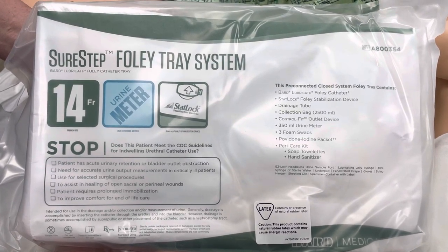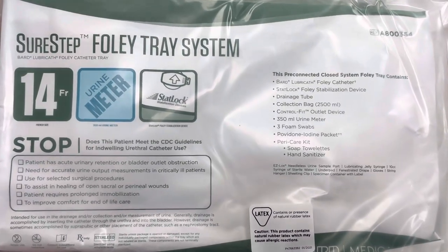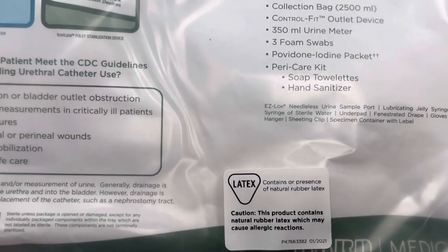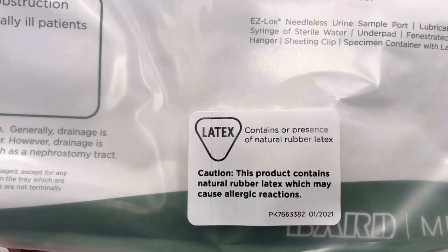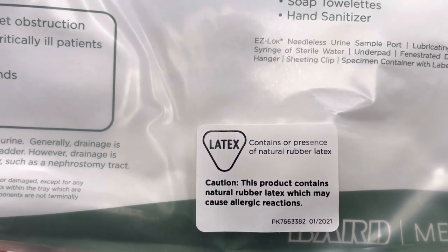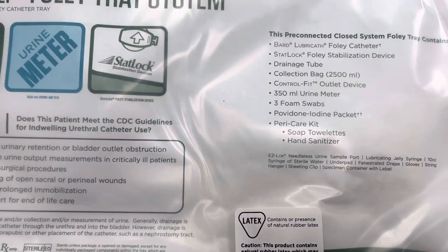Currently what we're stocking in the hospital is a SureStep Foley Trace System. This is a product that contains latex, so you will need to verify your patient's allergy list prior to inserting this to make sure they don't have a latex allergy. Additionally, this is packaged with iodine, so you would need to verify there's no iodine allergy for your patient as well.